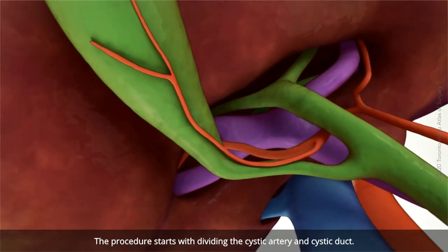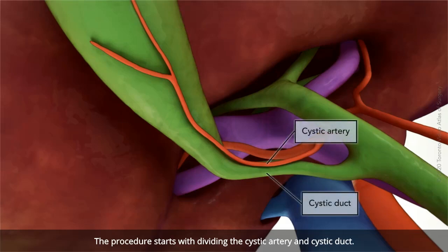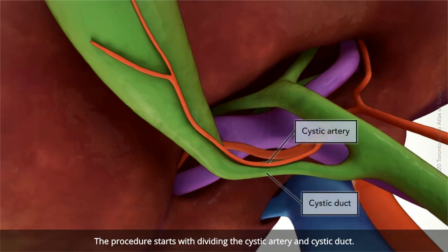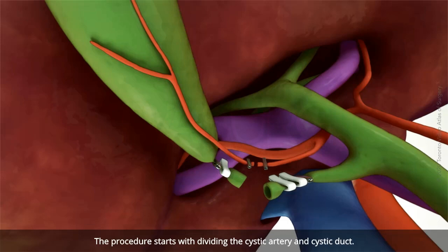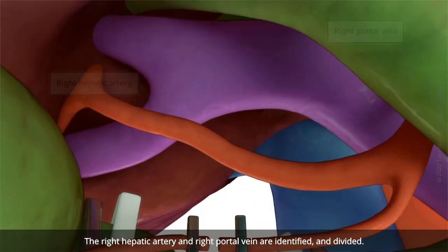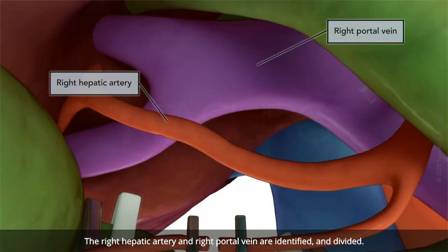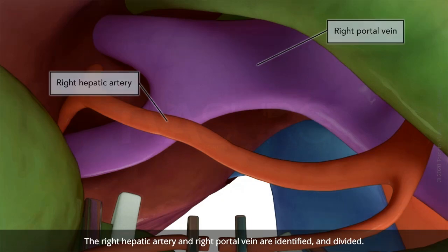The procedure starts with dividing the cystic artery and cystic duct. The right hepatic artery and right portal vein are then identified and divided.